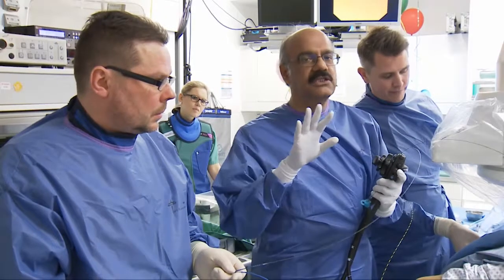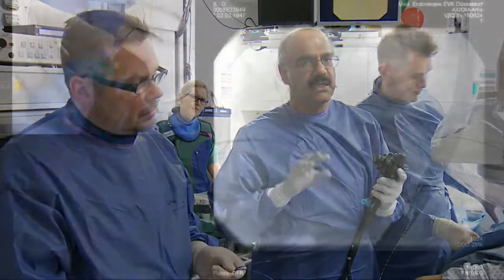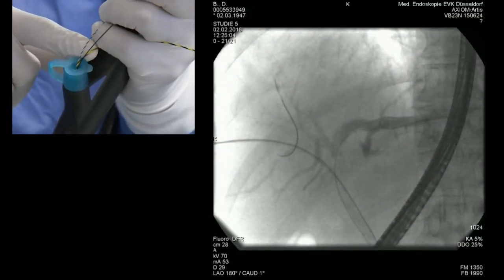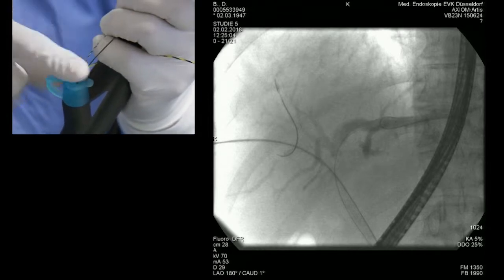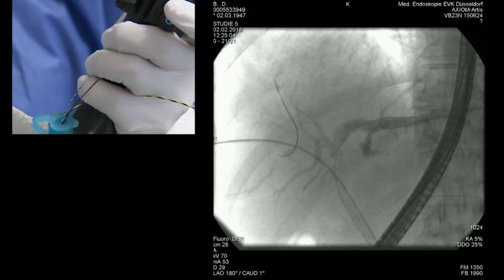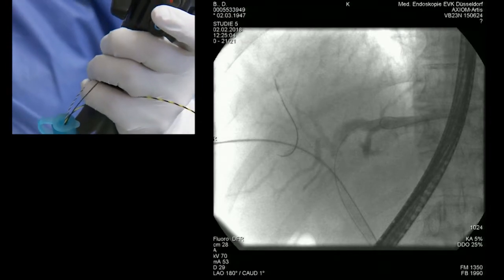This is very important: we are using three different types of guide wires here. First, through the percutaneous catheter we are using a hybrid jag wire. The second wire we used to get into the right anterior duct was the Bisiglide 2 wire. The third wire we used is an interesting wire called the GRIP wire.